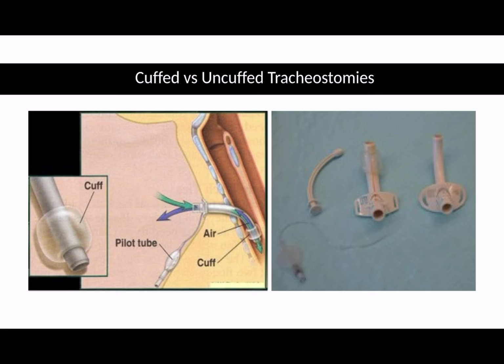If you remember back to the endotracheal tube video, all cuffs have a pilot balloon that dangles and sits outside. With the endotracheal tube, it's usually a blue pilot tube. In tracheostomies, depending upon the different makes, they can be different colours. Purple or white are the most common, but blue is also seen. The pilot balloon is a little balloon that blows up with a pressure of air that's similar to that seen at the cuff, and so it gives a good visual and tactile indication of the amount of air and therefore how inflated the cuff is inside the trachea.